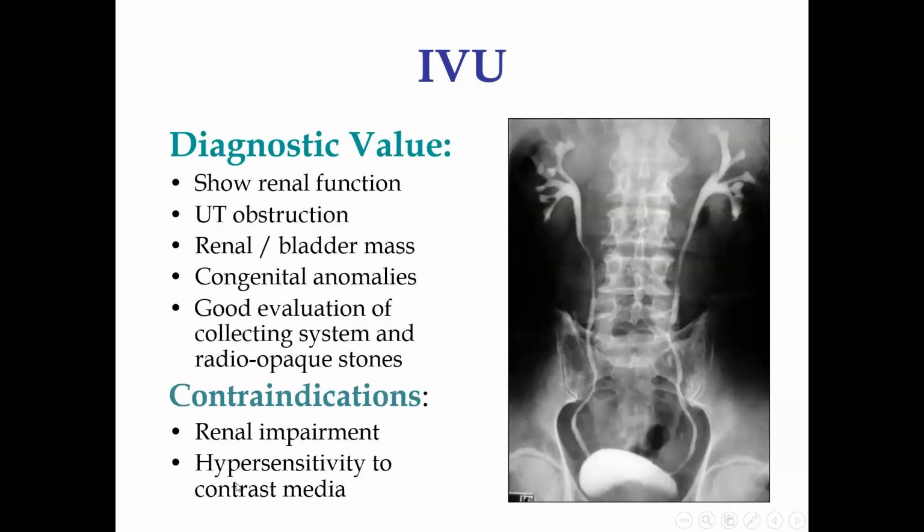Okay, so hypersensitivity to contrast media and renal impairment. So if the patient is already having renal impairment, like the urea creatinine levels are high and the GFR is say less than 30, would you be giving him contrast? You should not be giving.